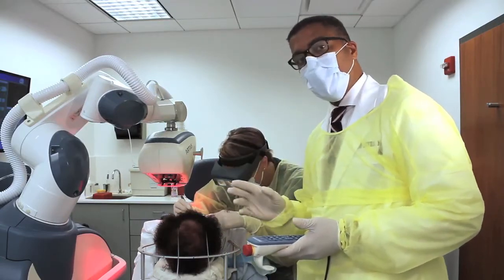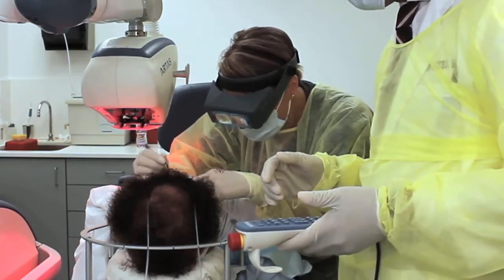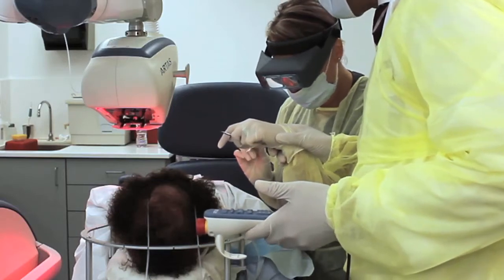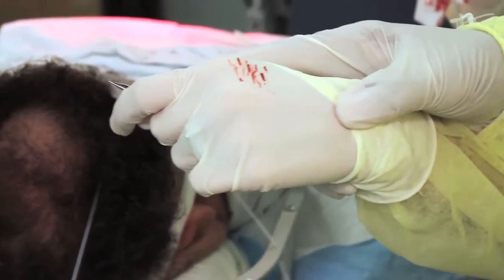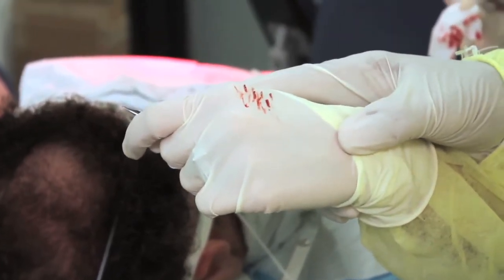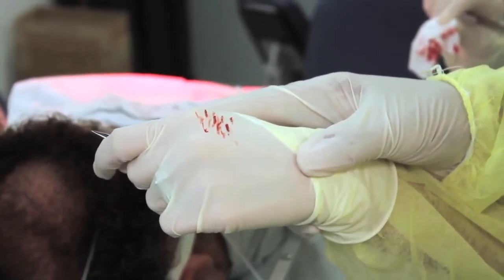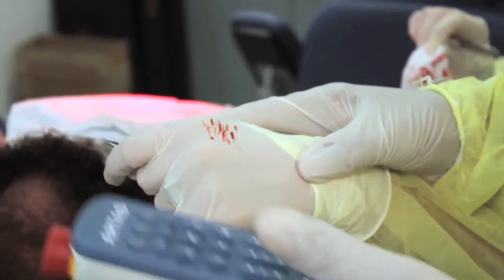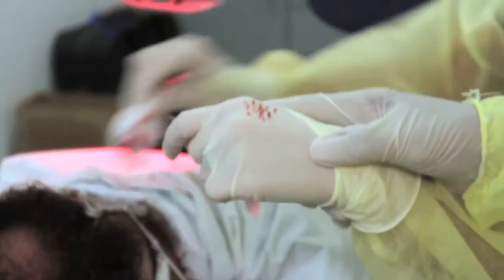So when we start punching a grid, just to make sure we're doing everything okay, we start pulling a few of the grafts just to check. We pulled some random grafts here and I'm taking a look. I don't have magnification on, but Ms. Ramirez, what do they look like? They're very good — all of them have intact follicles. We punched out 10, but we extracted more than half of those, and they all look good. Transection is injury of the graft. A follicular unit can be between one hair and four hairs. If you try to punch out a four-hair follicular unit and you chop off one, that's considered a transection. This all looks good to me. There's fat under the grafts. This is a one-millimeter punch. I think we're in business. So let's get some saline — some fluid on that so they don't dry out. And let's proceed.